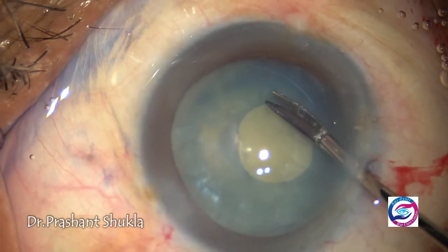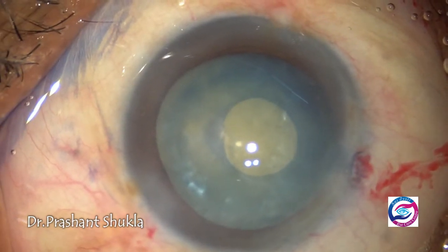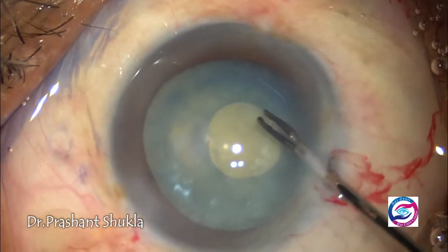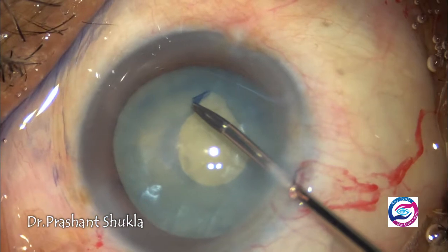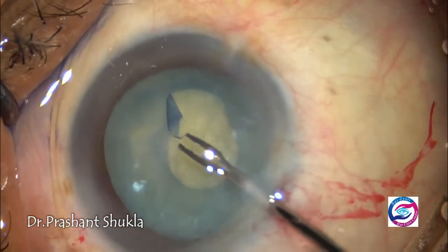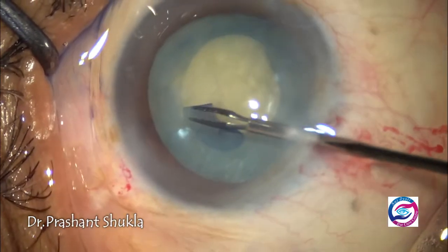The bag is now decompressed, and now I'm taking a micro scissors to make a tangential nick at the margin of the mini Rhexis. Now as the bag has been decompressed, the anterior capsule is going to behave just like normal, and now with the help of a micro Rhexis forceps, I'm making a secondary larger optimum size capsule Rhexis.